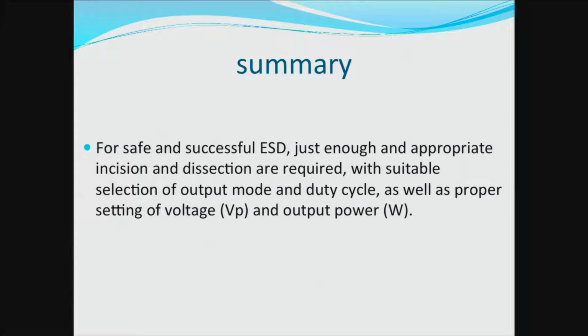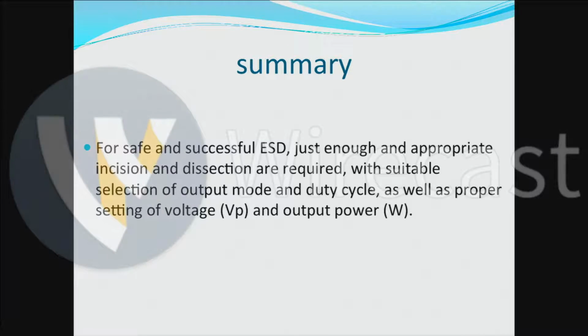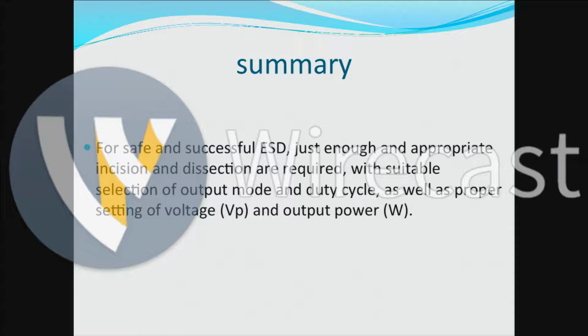My question is, in what kind of condition will the effect between coagulation and cutting be very close? Yes. Because sometimes we use forceps to do hemostasis.